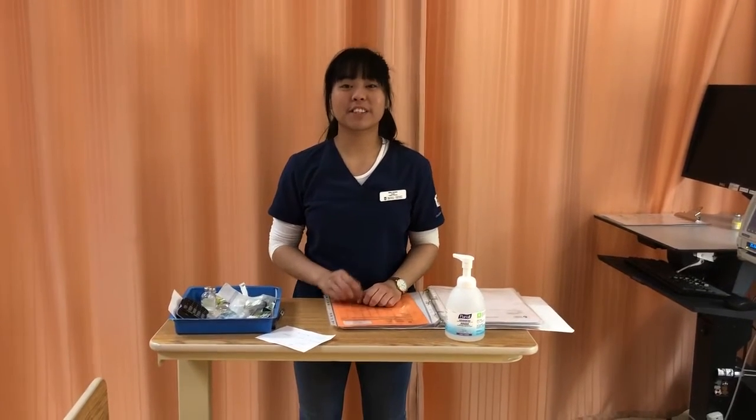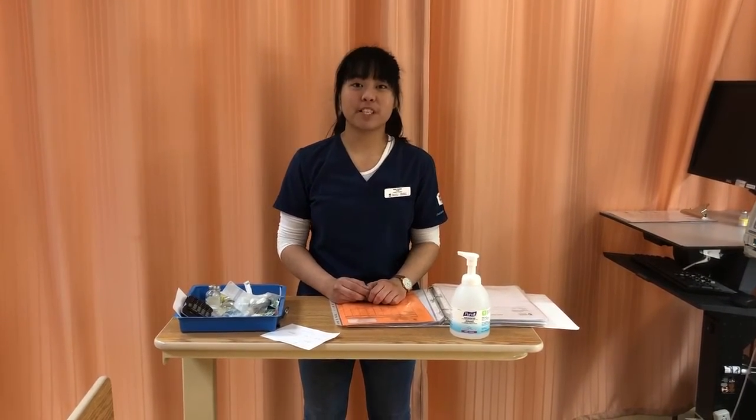My name is Rikka Yambao. I'm a third-year nursing student, and I will be demonstrating IV administration via Piggyback.